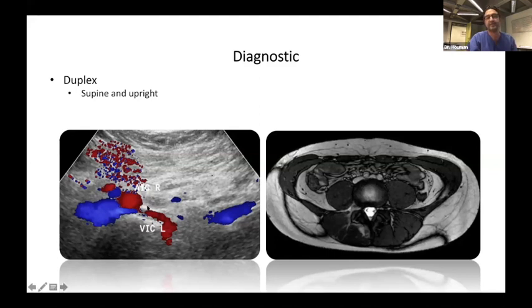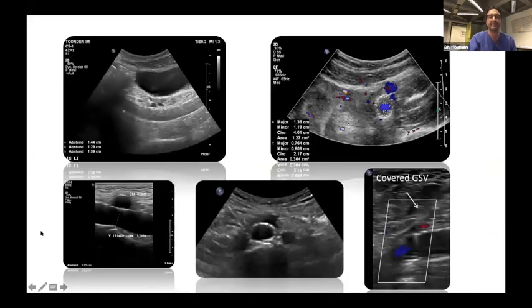And of course, I hope you can see the mouse here. You see the fibrosis of the vein. This is an important point which is created after years of compression. And we combine it again with MRV. This is the MRV in axial plane of the same young patient. You see the real severe compression. Again, an MRV or CTV is performed in supine position. So the upright position and duplex in Valsalva maneuver is very important.